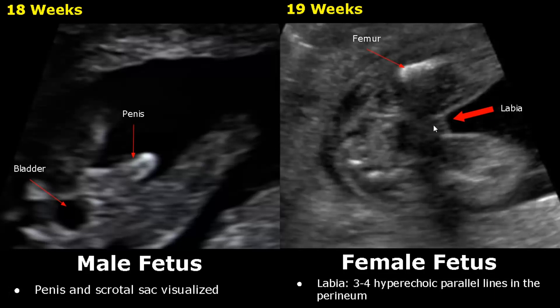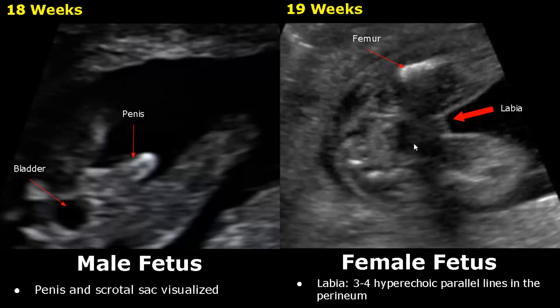Over here we have an image of 19 weeks. In a female fetus, the labia will appear as three to four hyperechoic parallel lines in the perineum. These hyperechoic lines are helpful in determining the gender — the gender will be female. It is partially obscured by the shadowing due to the femur, but we can still see the labia.